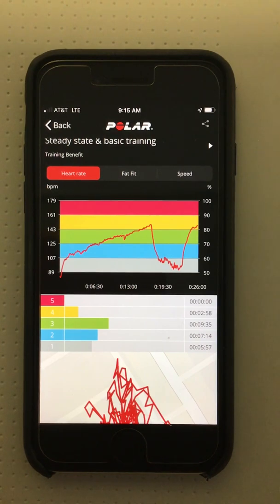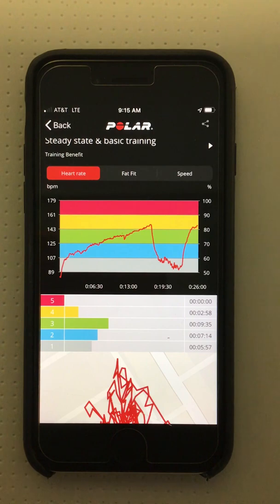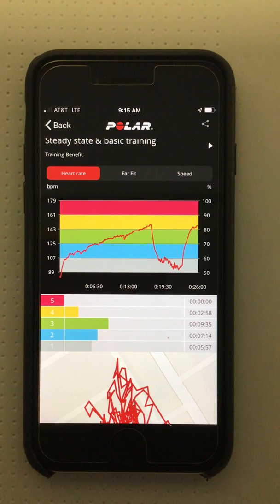The yellow bar indicates the amount of time in the high to very high zone, or 80 to 90% of heart rate max. This patient spent two minutes and 58 seconds in this zone.